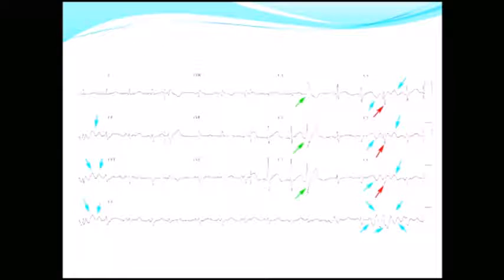All right. This is evidence of artifact affecting your ECG. So there's lots of causes, for example, if there's poor lead contact, if the patient's moving around, if they're shivering, if they've got a really hairy chest, you know, it's all going to affect your lead placement. I don't really remember what all this is. I just describe it as artifact affecting the baseline. You can say it's a shifting baseline. As long as you mention it, you should be fine.